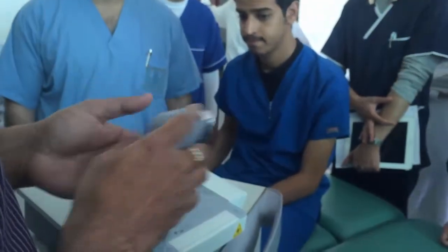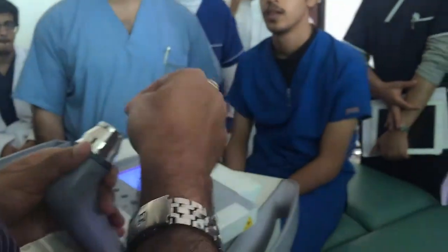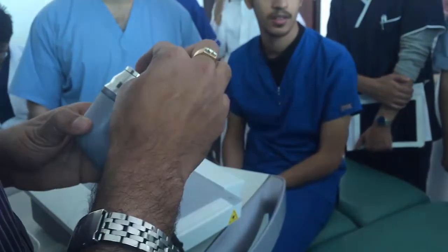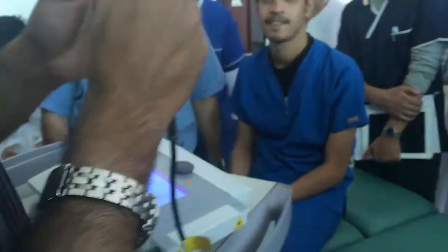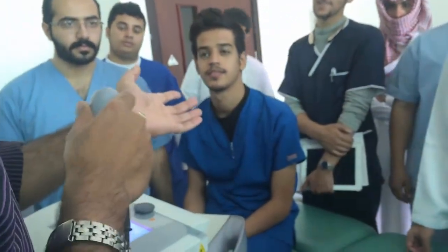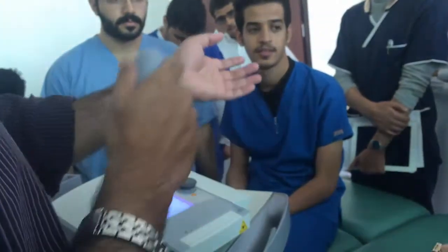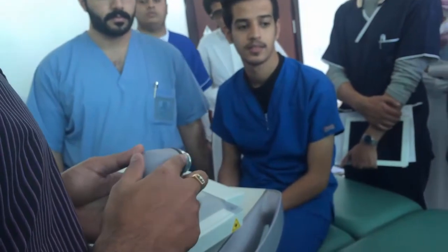If the wound is big and the laser beam should be 2 or 3. See, this is only one laser beam. I can't use banding technique. I can only use scanning technique. If there are 2-3 laser beams, then scanning or banding.